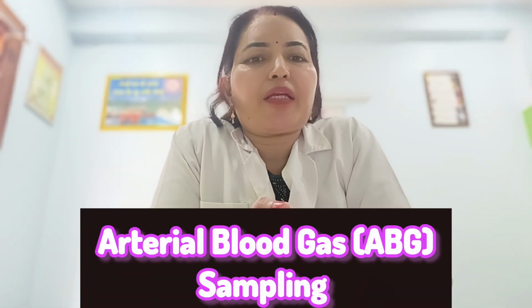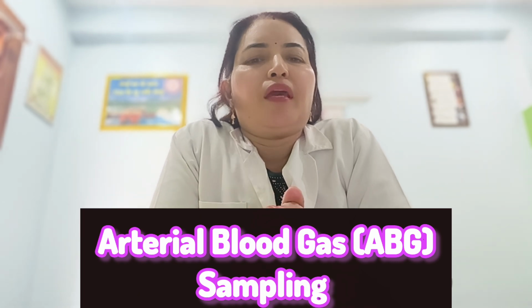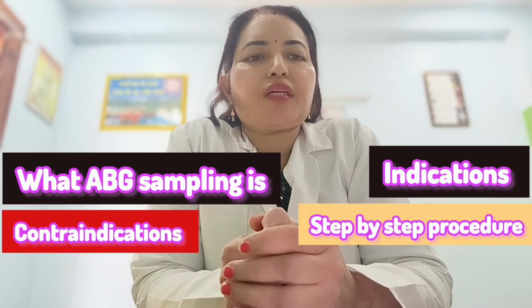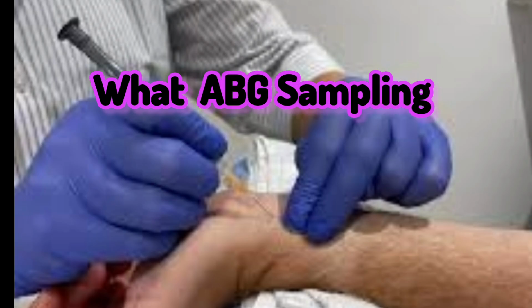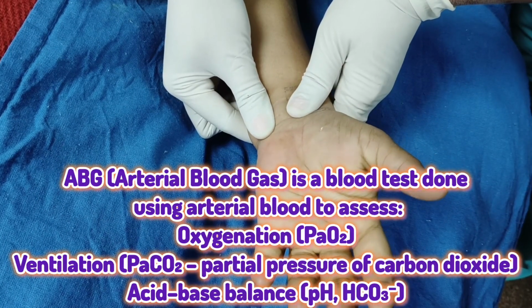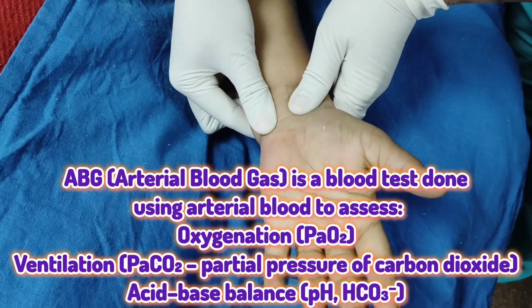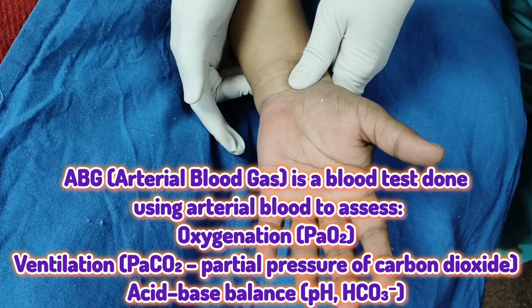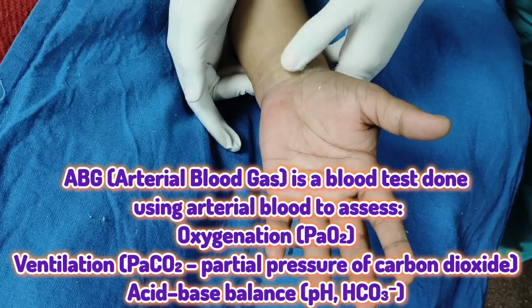Today we are going to discuss an extremely important ICU and emergency procedure, arterial blood gas sampling, commonly known as ABG sampling. In this video we will cover what ABG sampling is, indications, contraindications, step-by-step procedure and possible outcomes. What is ABG sampling? ABG sampling is the process of collecting blood from an artery, usually the radial artery, to assess oxygenation, ventilation, and acid-base balance of the body.